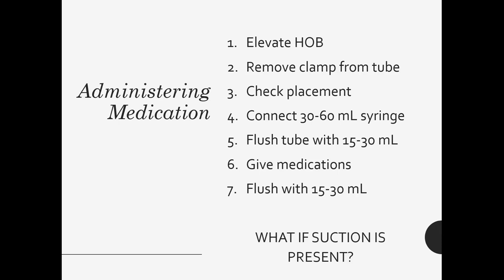So if they are hooked up to suction, you need to leave them unhooked from suction for at least 30 minutes to give time for the body to absorb the medications. So I usually suggest setting an alarm on your phone for 30 minutes. That way you get alerted when 30 minutes has passed, you can do your other stuff in the meantime and then go hook it back up to the suction. If they're not hooked up to suction, then you would just clamp it and leave it clamped until you need to use it again.